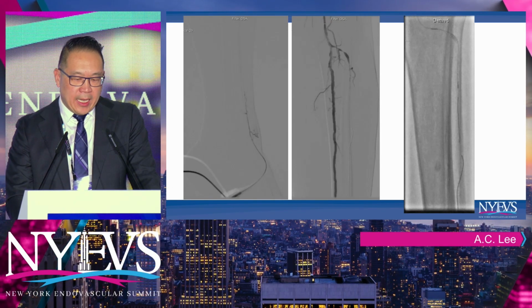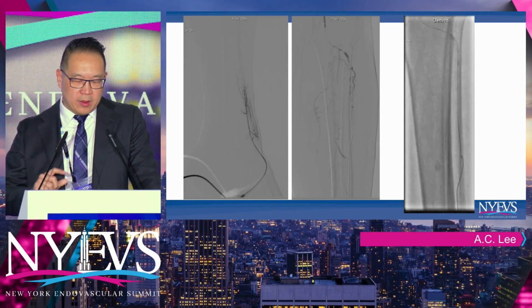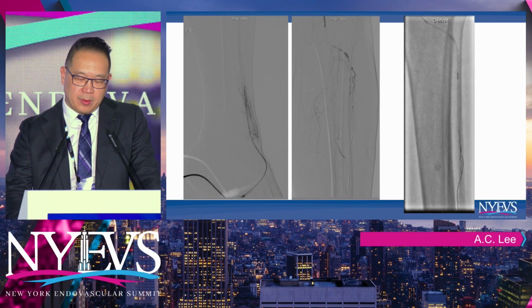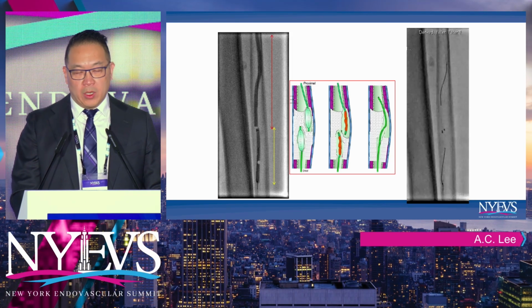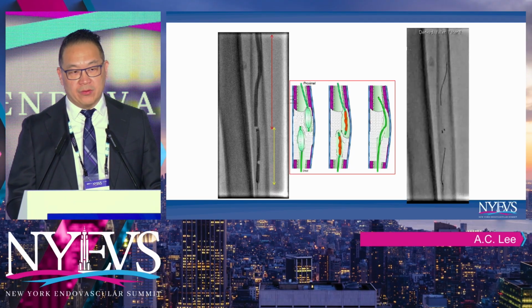I didn't like that my wire wasn't progressing from above, so I came from below. You can see the wire in the middle frame looks like it takes a bit of an awkward bend. And so I came back from above and pushed a little harder to the point where the wires were able to overlap.